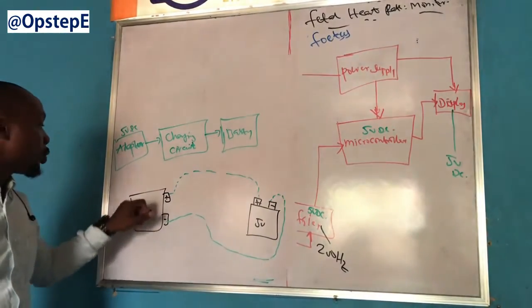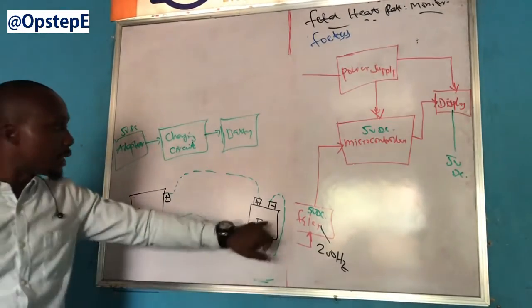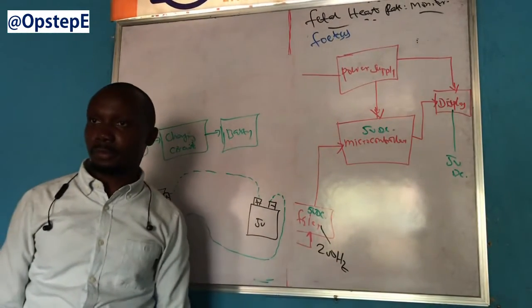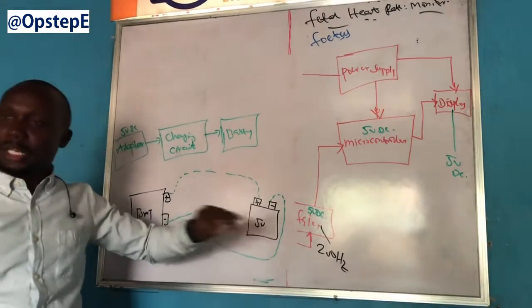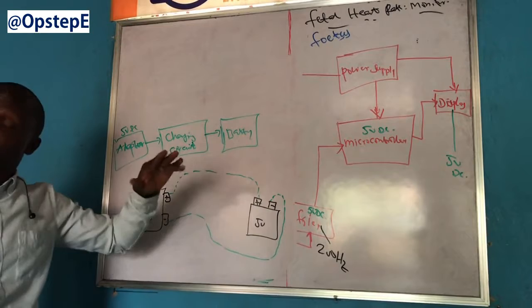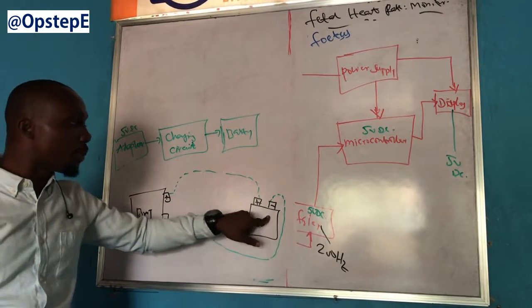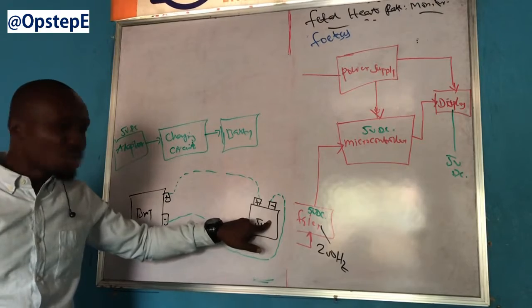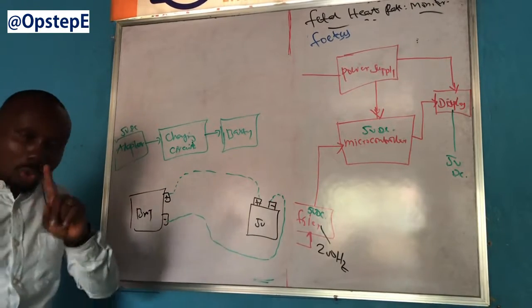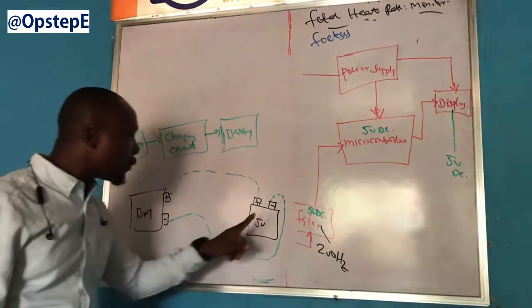Now, the moment the battery goes from 5 volts to 4.9, this system begins to misbehave, because this system is supposed to be operated at 5 volts constant. Now, the battery level is beginning to decrease. The voltage level is beginning to decrease. That will affect the proper working condition of the system. So, I will not go to the market to get a 5 volt supply to power a 5 volt system.